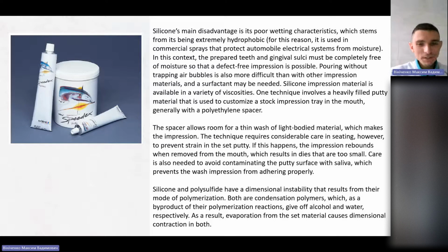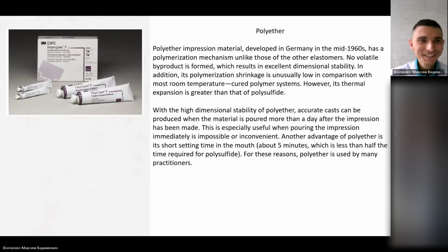So in Zaporizhzhia, for example, I'm working in 5 clinics, but in no one there is a polyether because it's very expensive. Mostly we use silicone alginates, but polyether is very expensive. It's for the VIP patients, not for everybody.